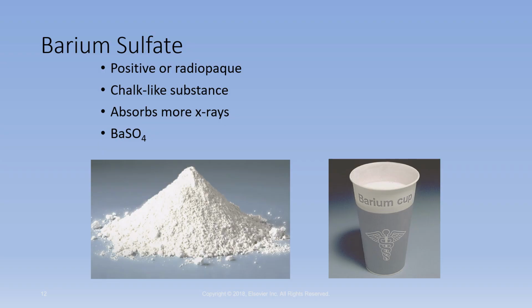The barium sulfate that we use, recognize that barium contrast media begins on page 473. On the contrast media, typically barium sulfate is considered a positive contrast media. We can also describe it as being radiopaque, meaning that X-rays do not pass through easily.